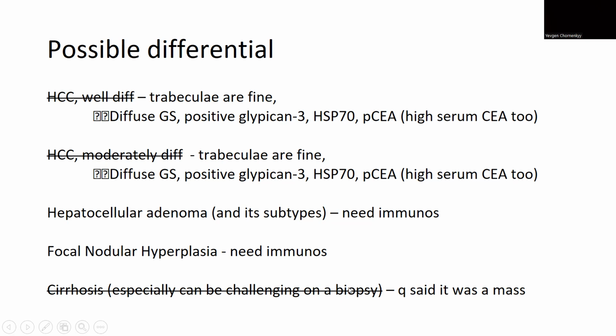So if you were to get this hypothetically on a board exam, you could rule out cirrhosis quickly, you could rule out cancer quickly, and then you'd be stuck with a 50-50. So that's kind of helpful. Would you order AFP as well? For HCC? For Dr. Nasser? I don't know. We didn't do it in this case.